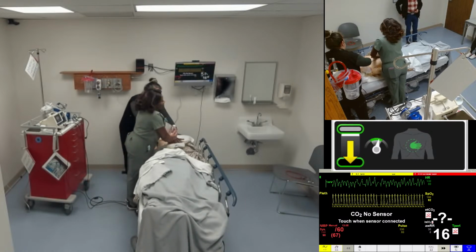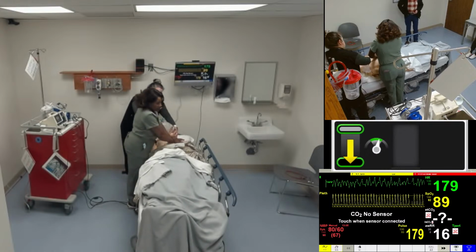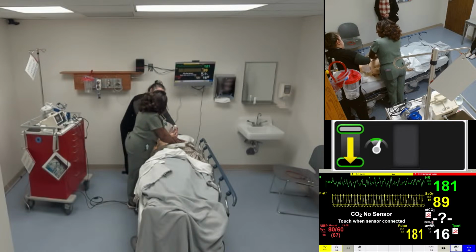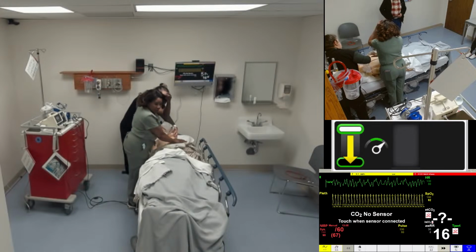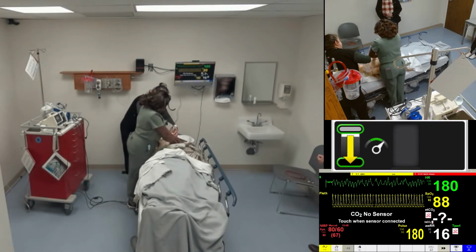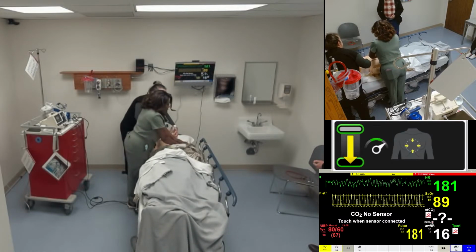So ventricular tach. Okay, so according to the ACLS algorithm, what are you gonna be doing? Besides doing CPR, we already have pads on him. He's gonna shock him in 2 minutes. Good. Any other interventions that you would like for a patient in VTAC? Not that I can come up with. You shocked once, what's gonna be your next thing? Shock twice. Okay, and then after another shock, what else are you gonna do? Don't we just keep shocking with the shockable rhythm?